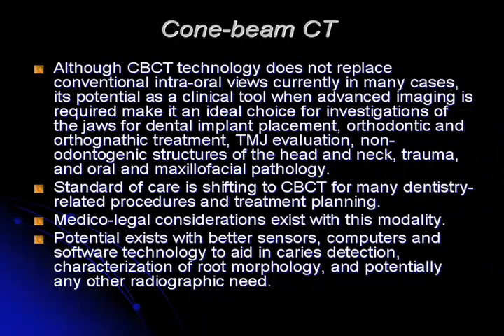So let me just conclude by saying that although cone beam CT technology doesn't replace conventional intraoral views, in many cases we still use FMXs, we still use bite wings, we still use panoramic radiography, but its clinical utility when advanced imaging is required makes it an ideal choice for investigations in dentistry, particularly dental implant placement, digital treatment planning, follow-up for dental implants, orthodontic and orthognathic treatment planning and treatment follow-up, TMJ evaluation, non-odontogenic structure evaluation, like soft tissues in the head and neck, where I showed you things like calcified structures.